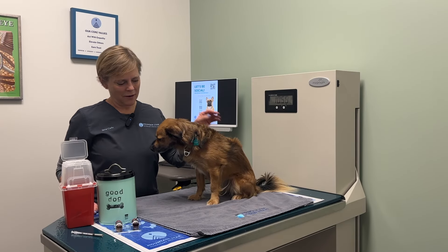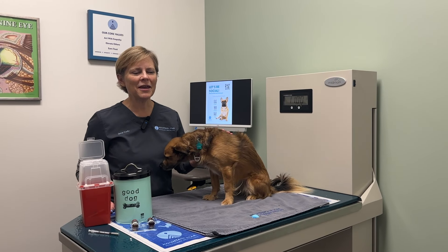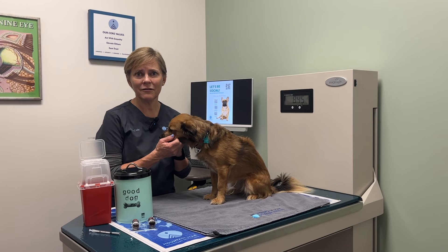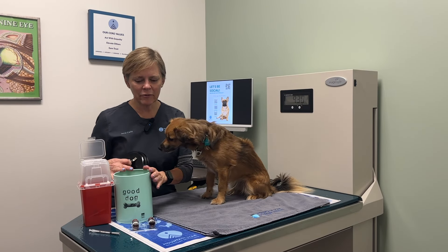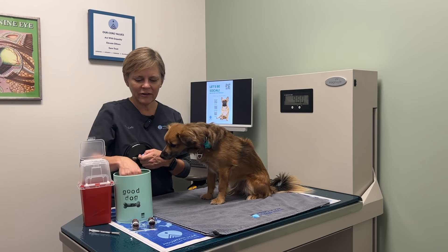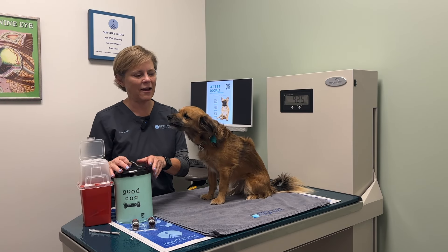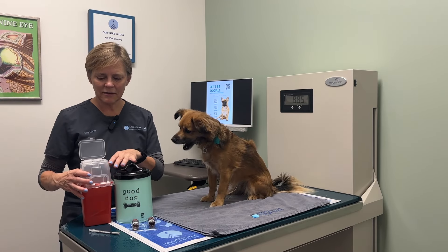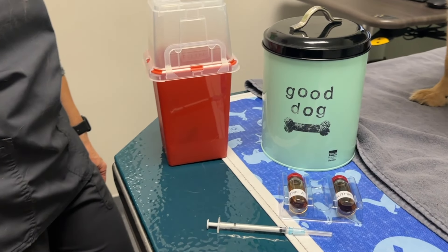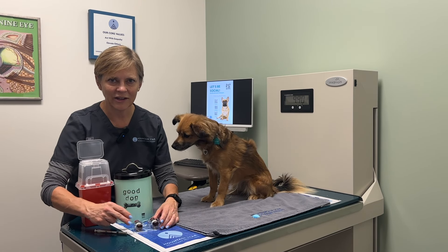Whenever we're doing subcutaneous injections, it's a really good idea to try to make this something that is fun for your dog or cat. Having some very high reward treats is important — Ruthie just loves these treats and she only gets them when she's having her injections. You want to have your treats, your sharps container, your syringe with needle, and the medication that you're going to be injecting.